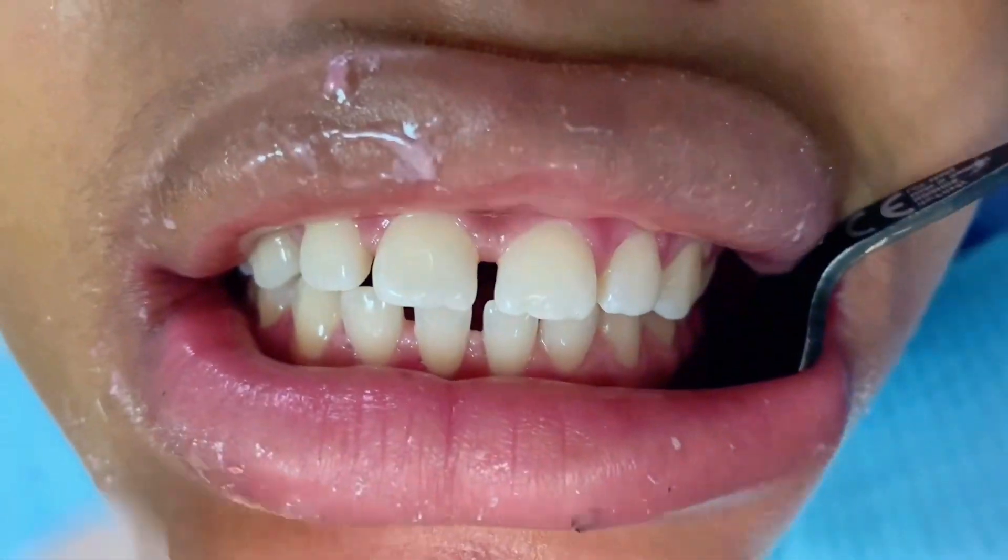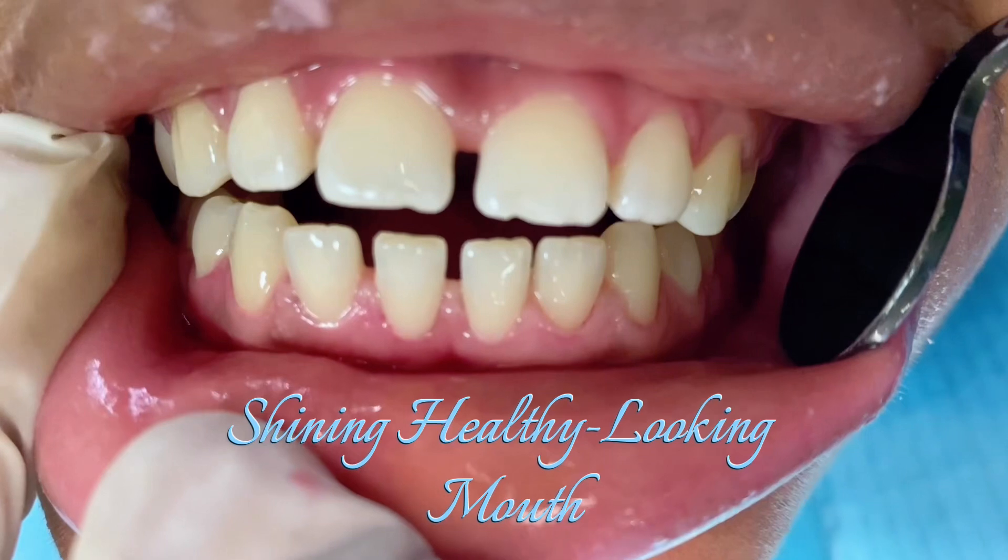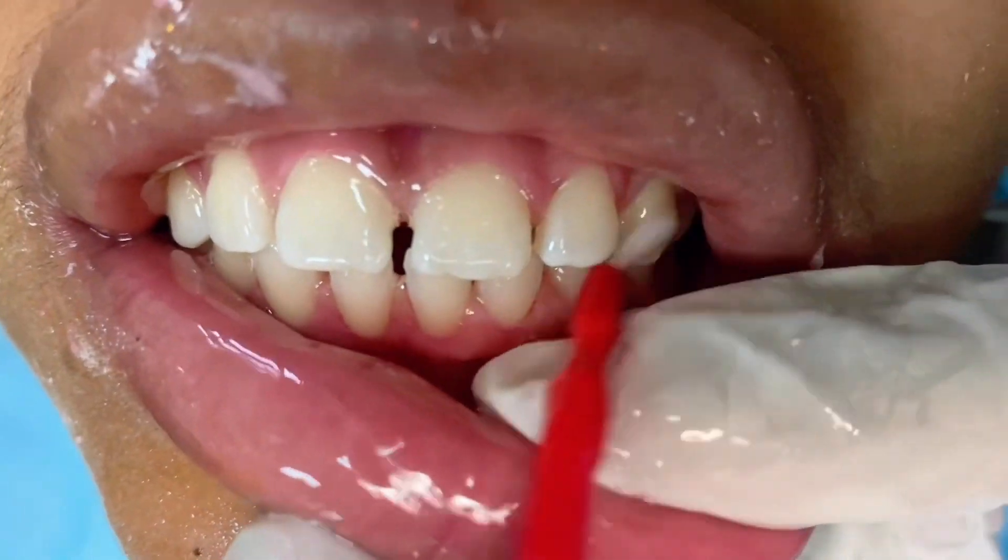I trust you could see the outcome of the dental cleaning — shining, bright, and healthy-looking teeth and gums. That's the goal.